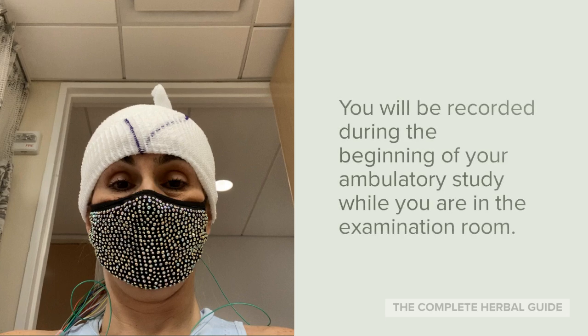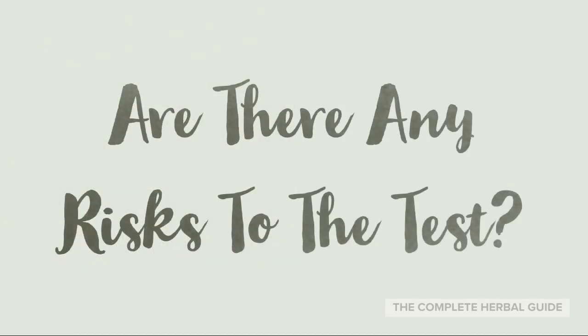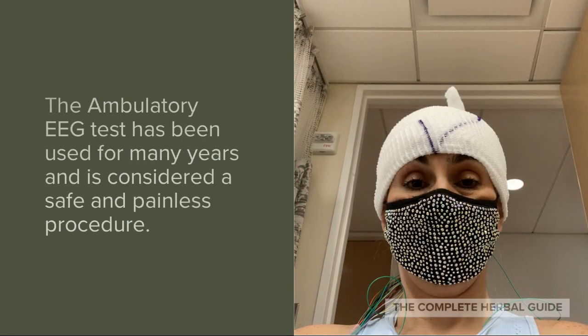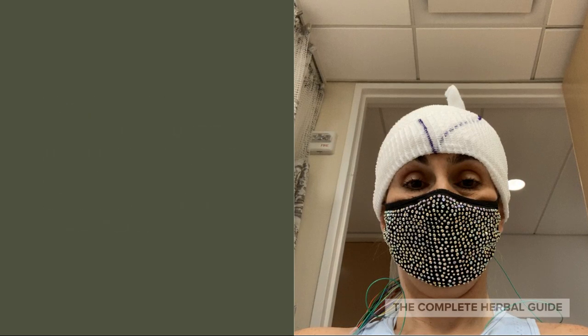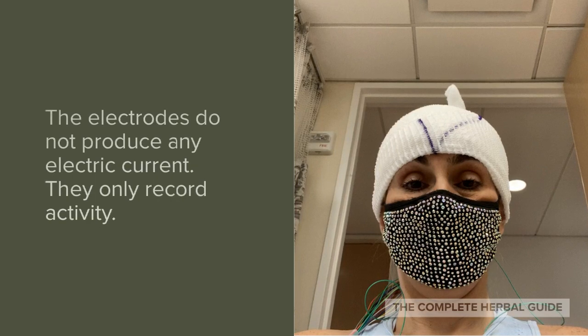You will be recorded during the beginning of your ambulatory study while you are in the examination room. The ambulatory EEG has been used for many years and it's considered to be a safe and painless procedure. The electrodes do not produce any electric current — they only record activity.